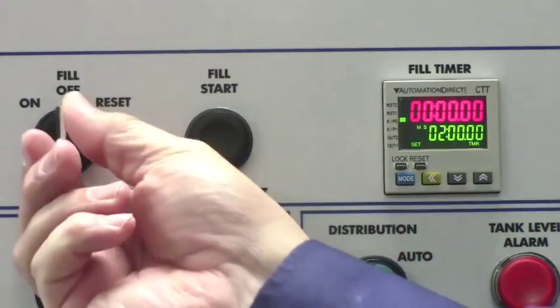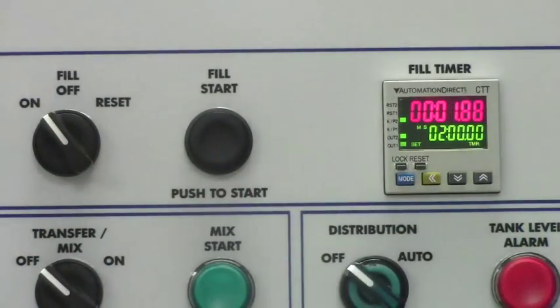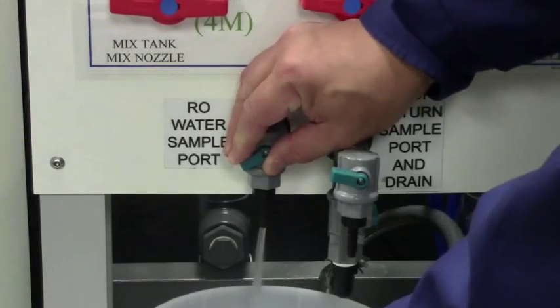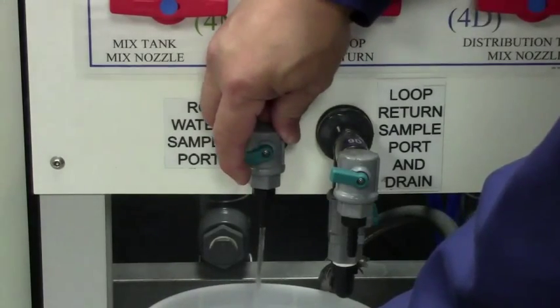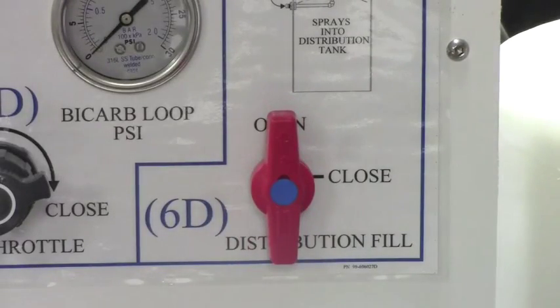Turn the fill switch on and push the fill start button. Upon completion, turn the fill switch to reset. Open the RO water sample port for at least 10 seconds, then close it. Open valve 6D for at least 10 seconds, then close it.